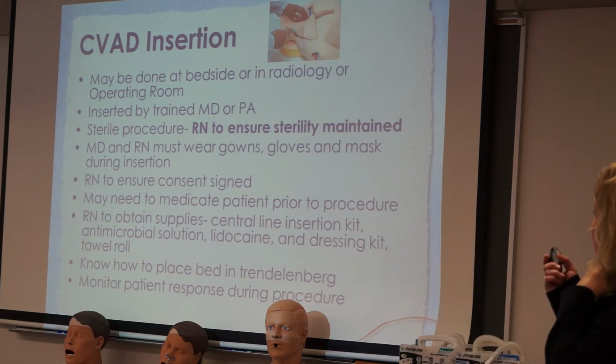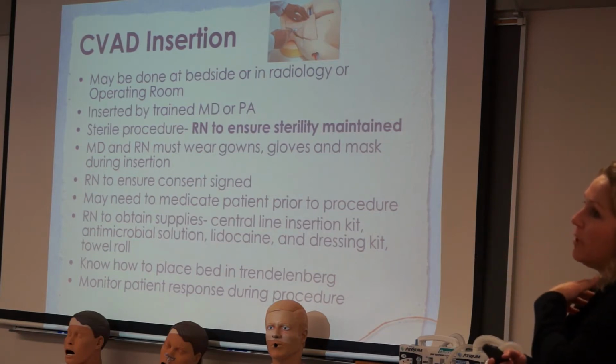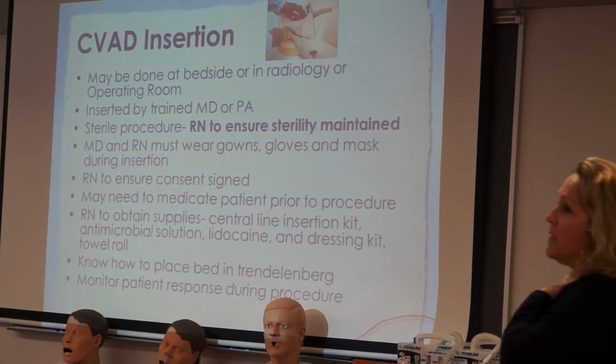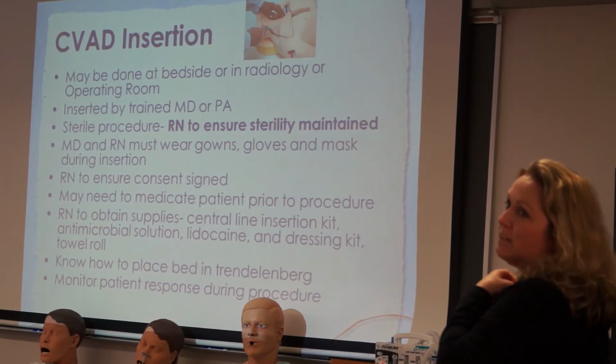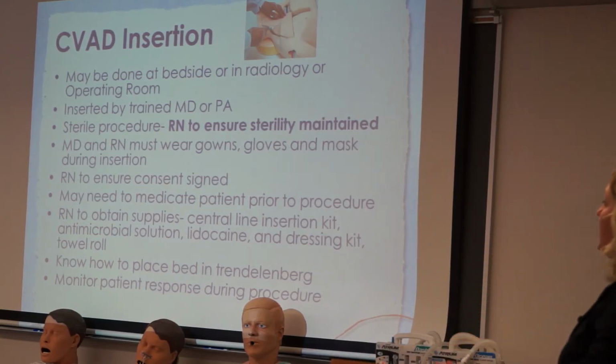Now, medication prior to procedure, they may medicate a patient to keep them calm for a central line placement, like if it's going to be a tunneled catheter, because that would be painful. Ports, absolutely. They use some Versed and fentanyl to sedate those patients for that procedure. PICCs and midlines, it's just lidocaine, just local, just numb up the area. It's like a bee sting, and then the access is made.